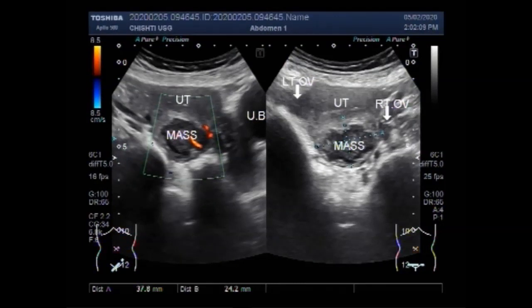Dear viewers, I hope you are all fine. This ultrasound video shows a fibroid in the uterus.